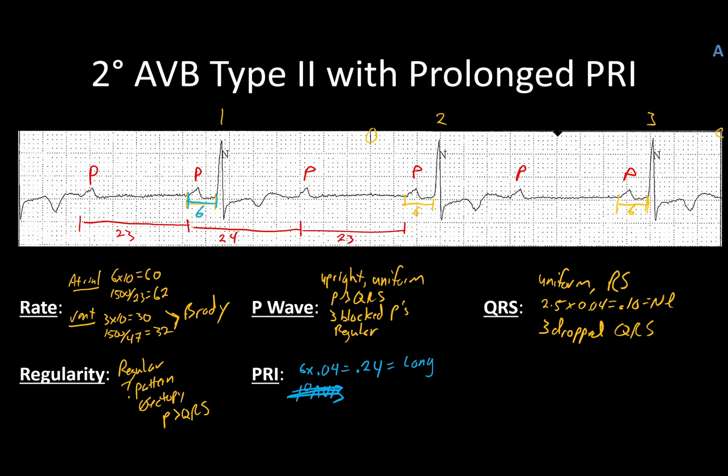So you think about it, in second degree block, that's happening because the AV junction is broken in some way. First degree block happens when the AV junction is broken in some way. However, second degree is worse. It's more broken. So it makes sense that you could have a slightly broken problem, first degree block, advance to the point of having a second degree, and both are occurring at once. And so for that reason, we actually let the second degree block stand out as being more important because it's more severe. You're dropping heartbeats.